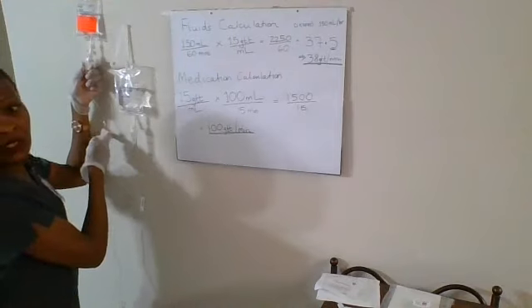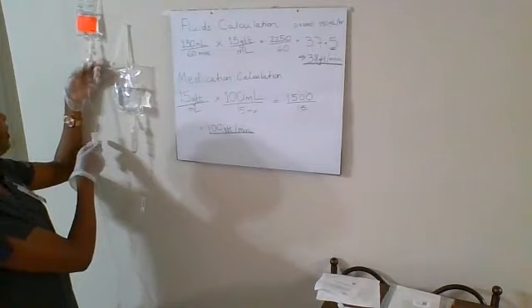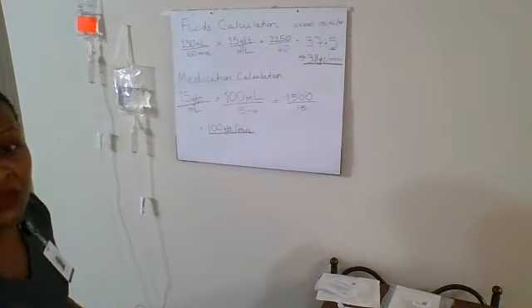And there we go. I now have counted 100 drops for a whole minute, and my IV is ready.